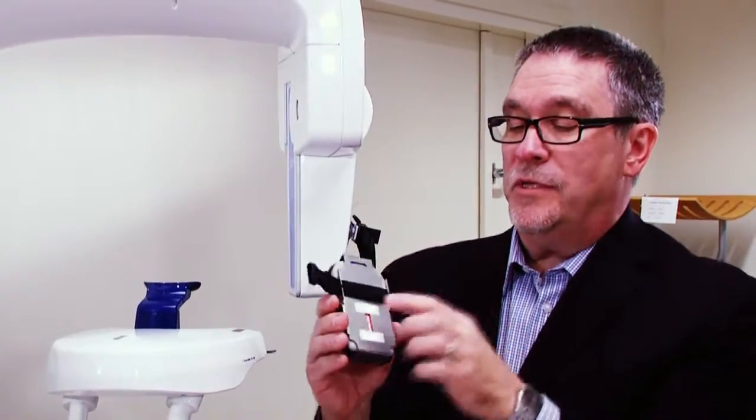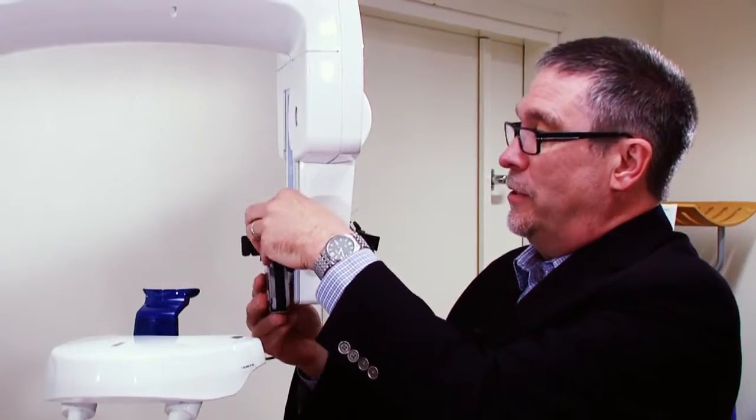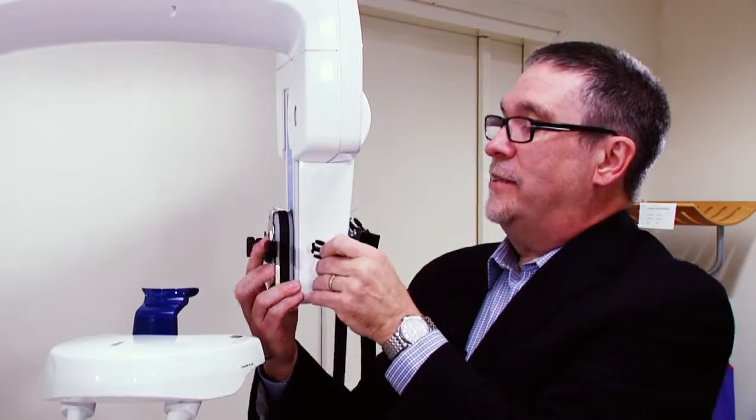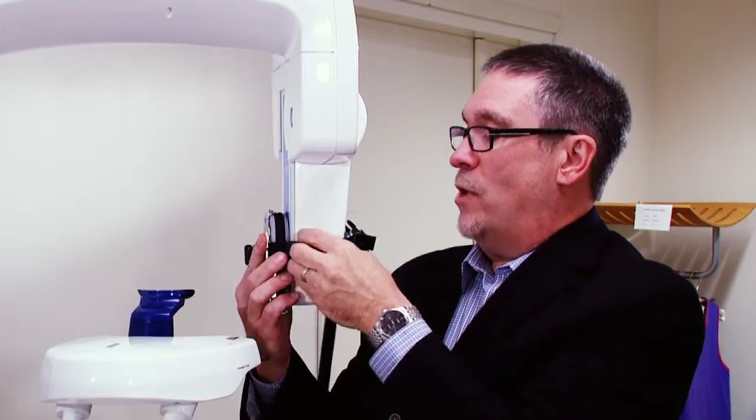Once that's done, you take your Piranha, with this side out facing the x-ray beam, or the tube, place it like so, and take the adjustable strap, and connect it to the Piranha holder.